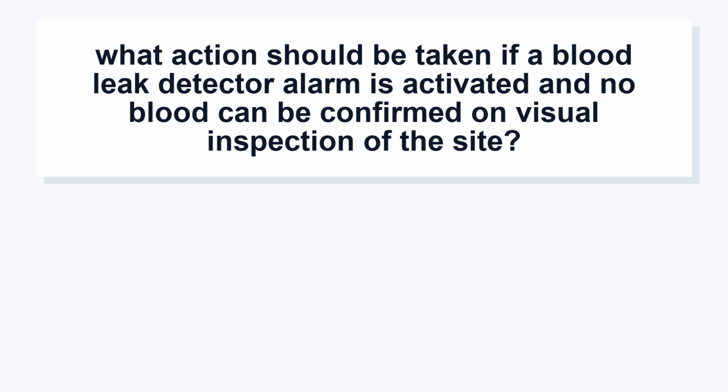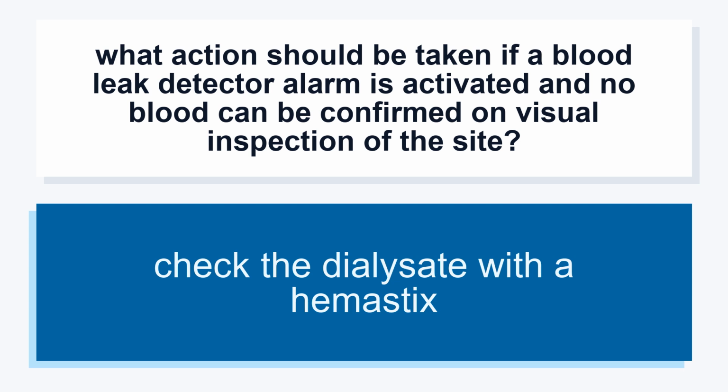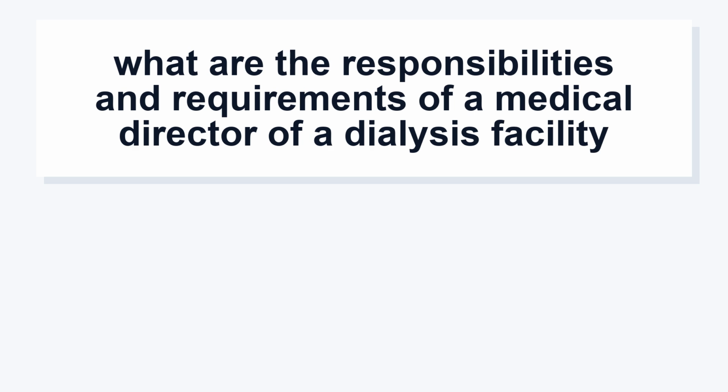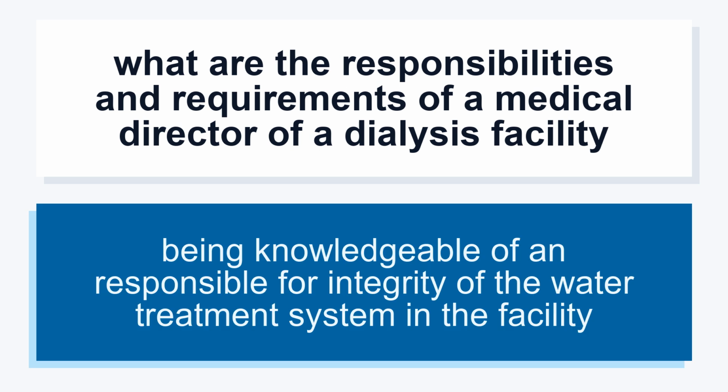What action should be taken if a blood leak detector alarm is activated and no blood can be confirmed on visual inspection of the site? Check the dialysate with a Hemastix. What are the responsibilities and requirements of a medical director of a dialysis facility? Being knowledgeable of and responsible for integrity of the water treatment system in the facility.